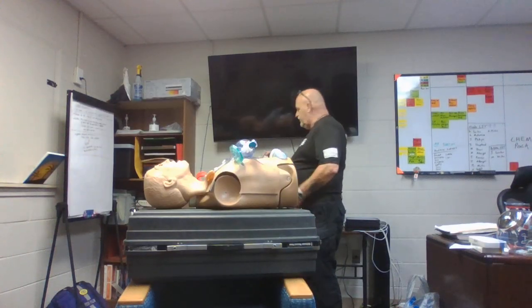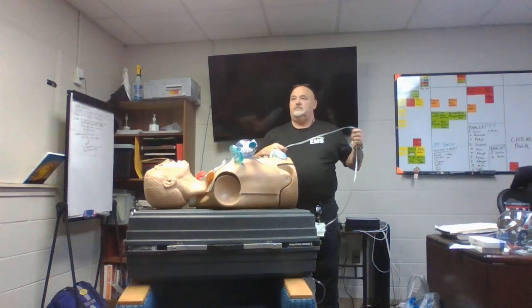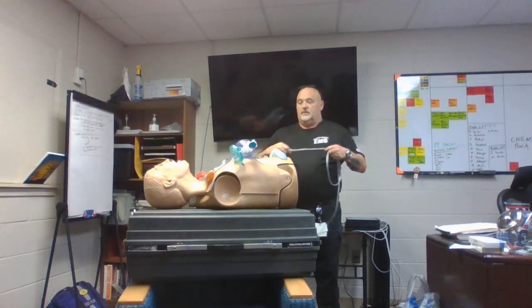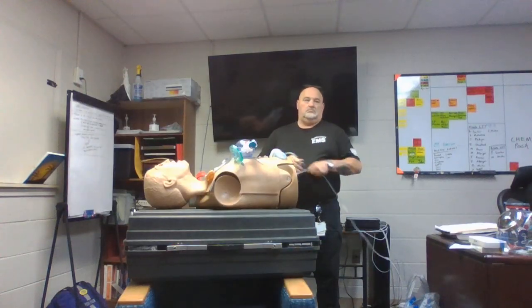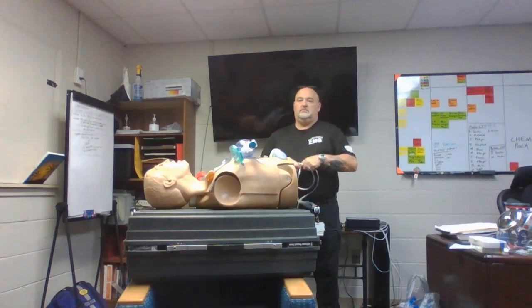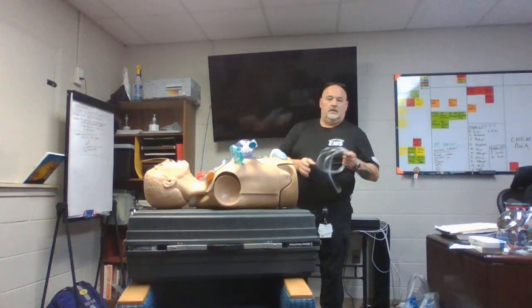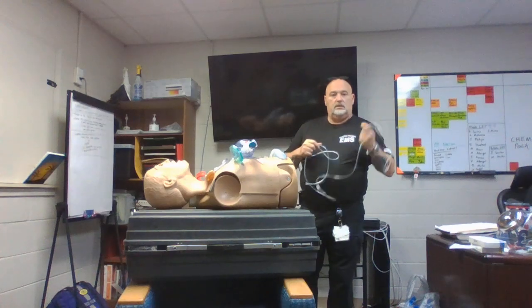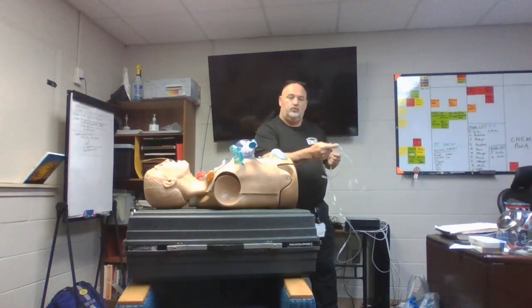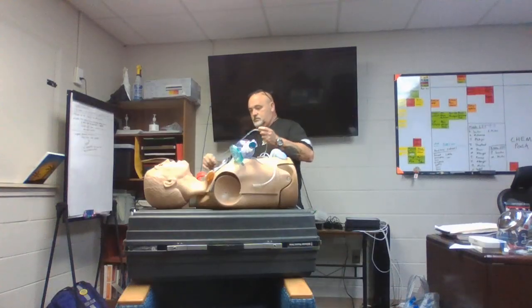Talk about these patients that present with chest pain or having a hard time breathing. Their SATs are 90, 93, 94 even. We can use this beautiful nasal cannula and set that flow rate at about 2, right? We can put this on the patient.